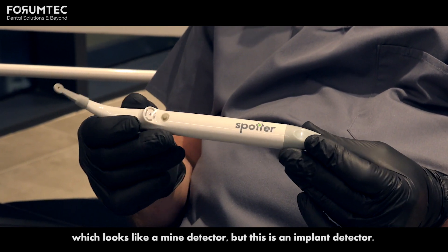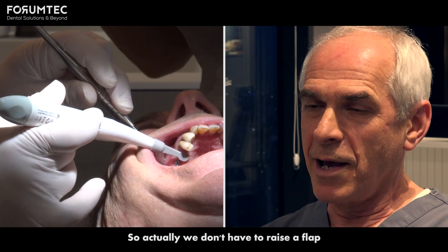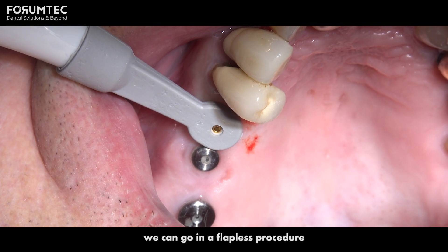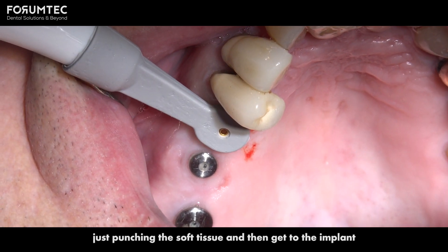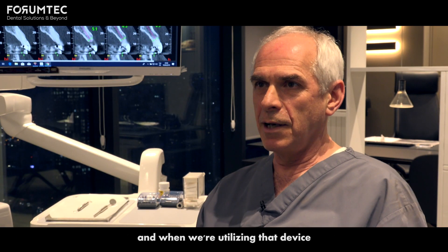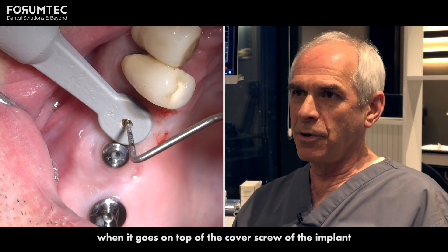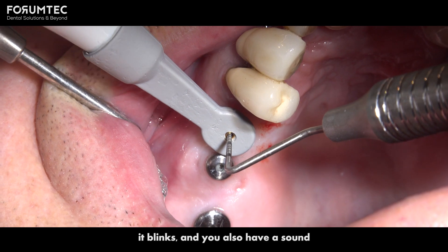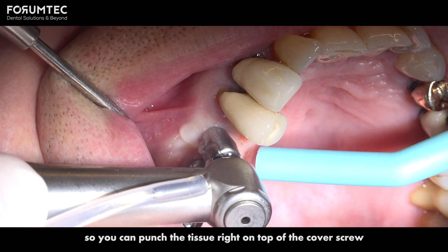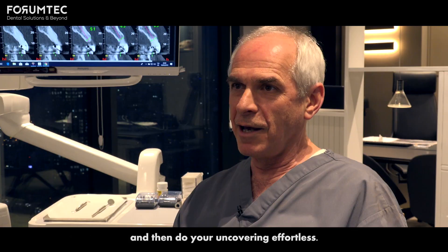In order to do that, we are using the spotter, which looks like a mine detector, but this is an implant detector. We don't have to raise a flap — we can go flapless, just punching the soft tissue to get to the implant. When that device goes on top of the cover screw of the implant, it blinks and makes a sound, so you can punch the tissue right on top of the cover screw and do your uncovering effortlessly.